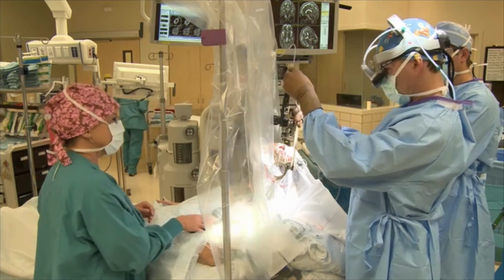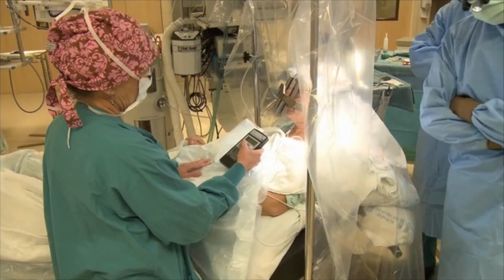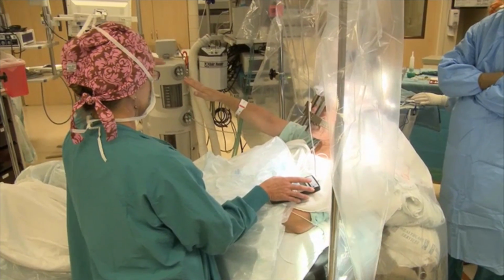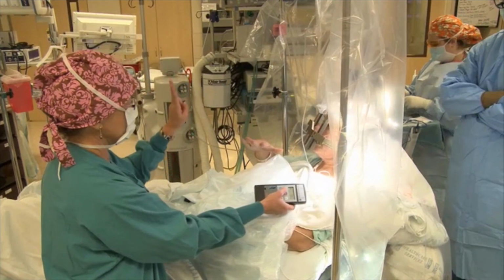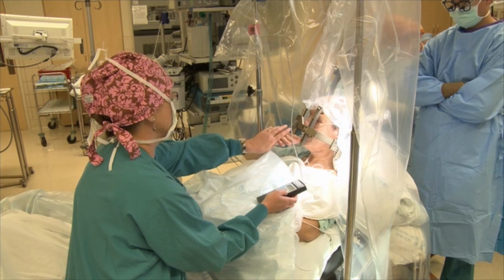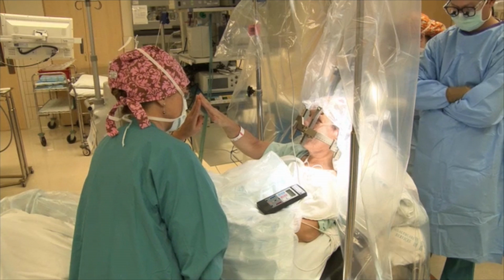Actually, we've placed the electrode already into the VIM target, and we're now just connecting that cable that goes from the sterile part of the field to the non-sterile part over to Diana's controller here, and she's now just starting to turn on the stimulation. You can see we're asking Vicky to perform some actions that will let us know how well the stimulation is working. It's important to understand that we're taking people through the entire range of possibilities that we'll do as an outpatient, all within 10 or 15 minutes in the operating room. And so we routinely stimulate at levels that are significantly higher than we would ever anticipate stimulating once this procedure is complete.